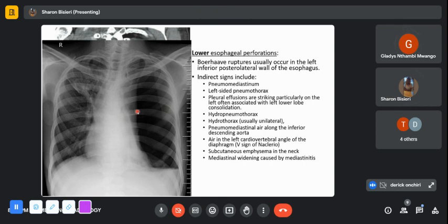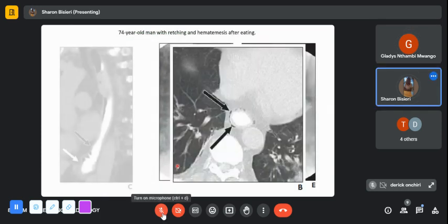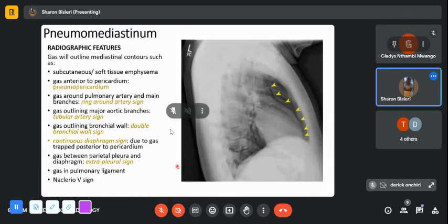It's important for us usually to also comment on these technical issues because it will supersede our interpretation of some of the findings we have. Yes, that is actually important, and it points towards the limitations of the image that you're reporting on. It covers you in case you make any misdiagnosis, especially when it is a medico-legal issue. So it is important. That's what's supposed to be done.